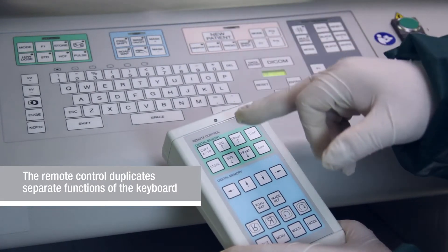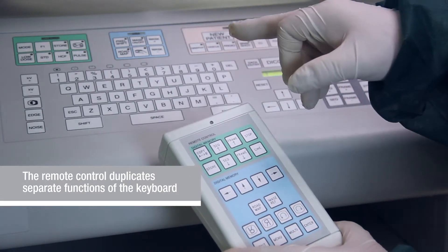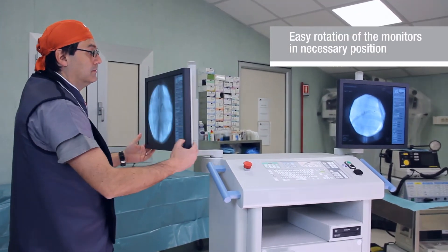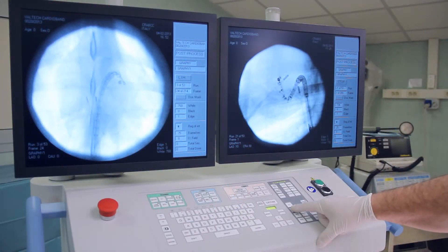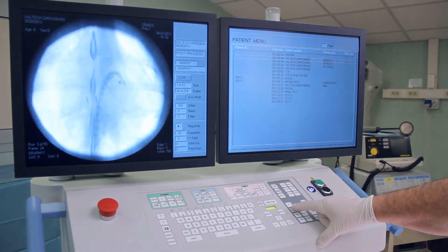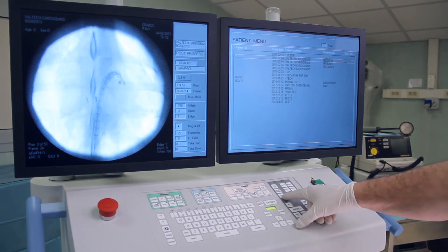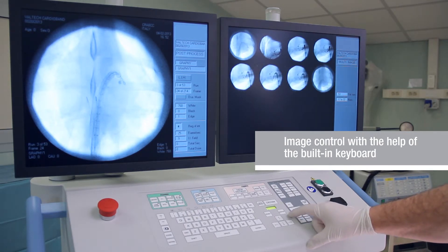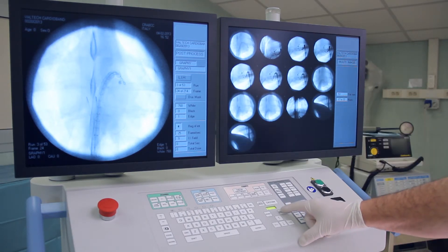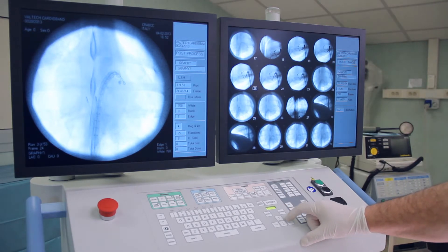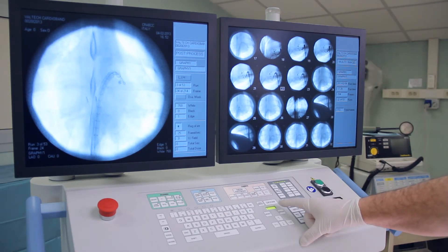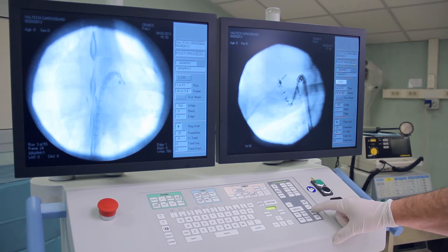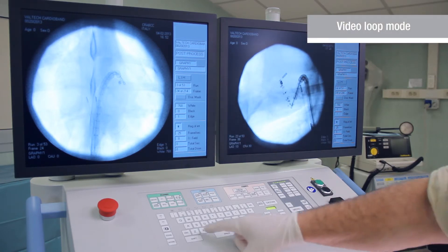Image control functions include recording, image saving, displaying several images on a monitor, video loop, and more. Monitors are fixed to the trolley with the help of flexible bars. A monitor stand has an integrated doctor's workstation. It is possible to choose indicative images or series of images, process them and make a detailed analysis of the data during or after an operation.